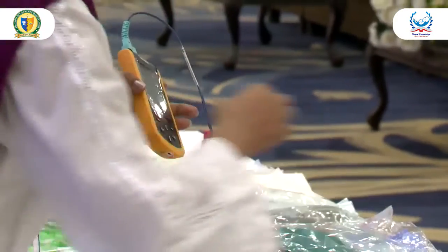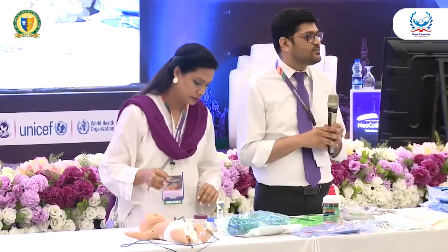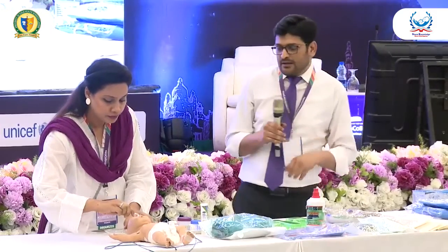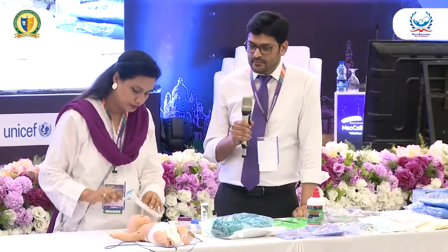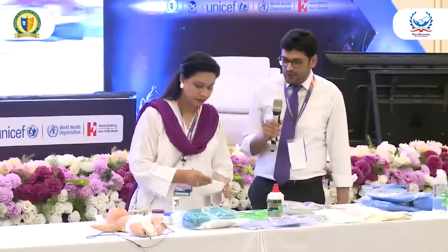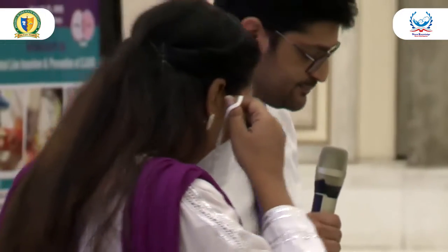We will attach the baby to the cardiac monitor, and we will give an oral analgesic, sucrose solution, as Professor Irfan Waheed mentioned, to relieve the pain of that baby. That will be just the pain of the needle prick. Our equipment has already been prepared. Now, we'll put on our mask and put on our cap.